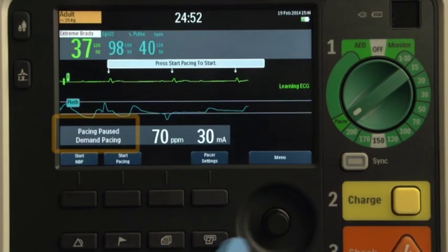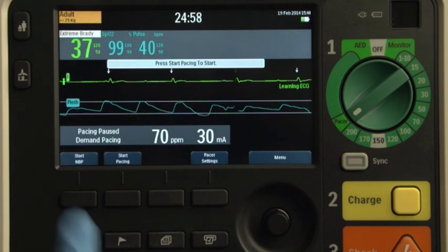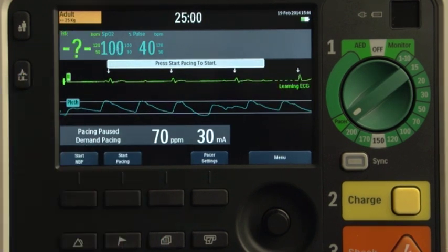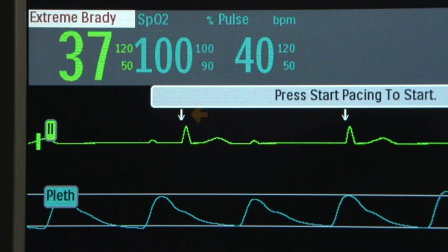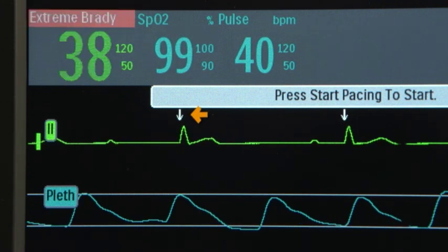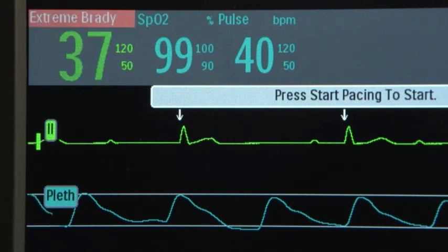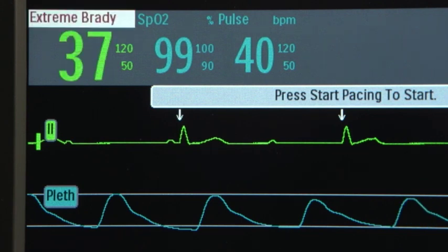This message indicates that the pacing function is enabled but paced pulses are not being delivered. Press the lead select button to select the best lead with an easily detectable R-Wave and verify that a single white R-Wave marker arrow appears above or on each R-Wave in Wave Sector 1. If the R-Wave markers do not appear, are incorrectly labeling beats, or do not coincide with the R-Wave, select another lead.